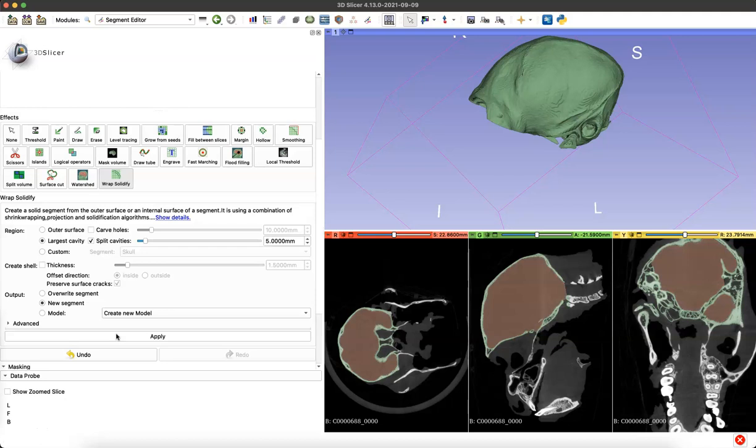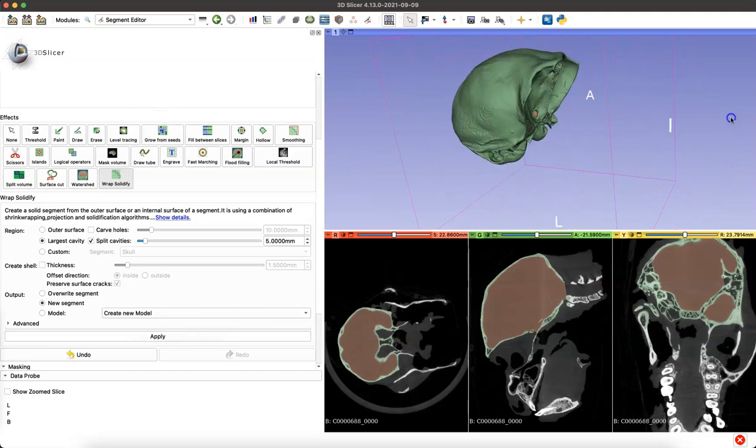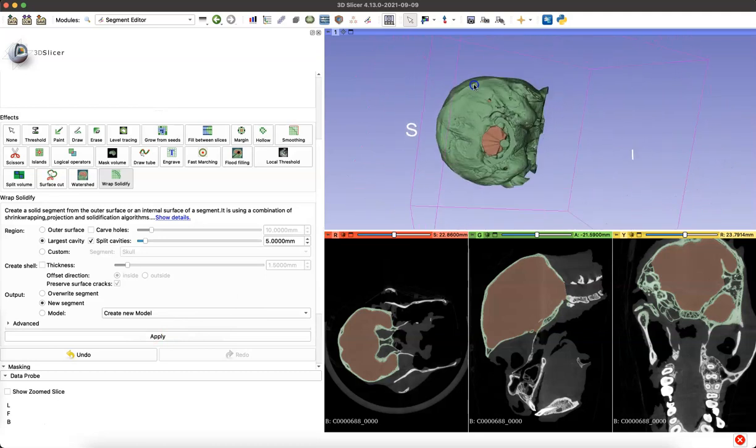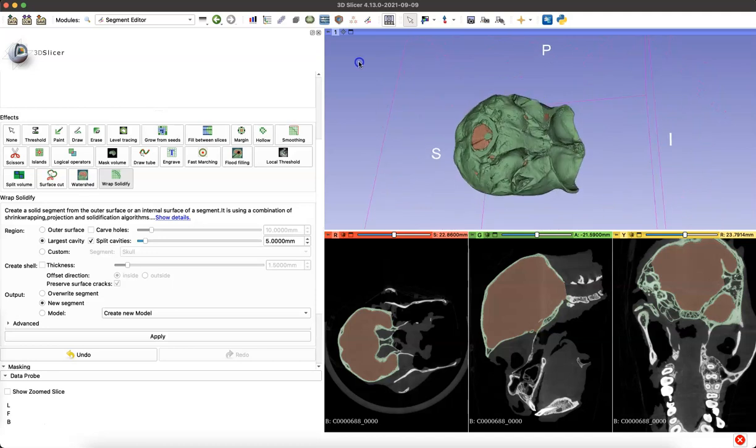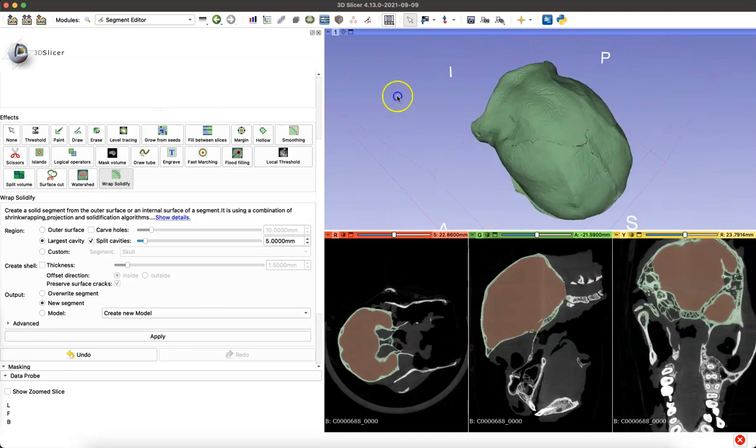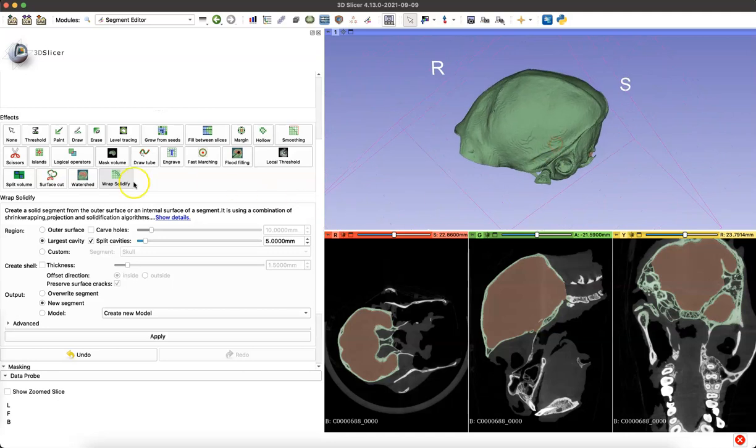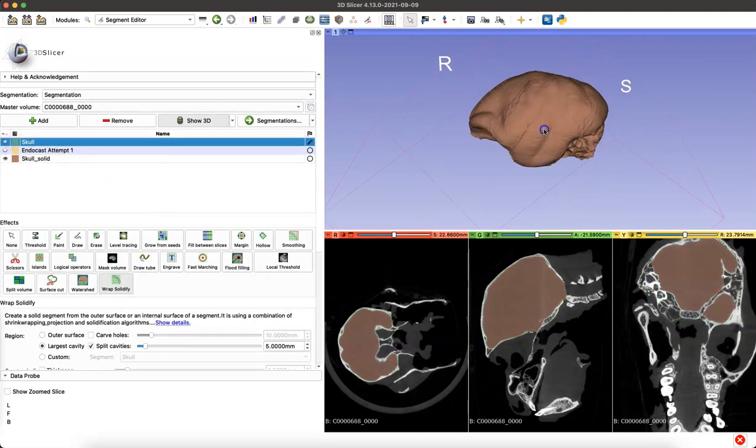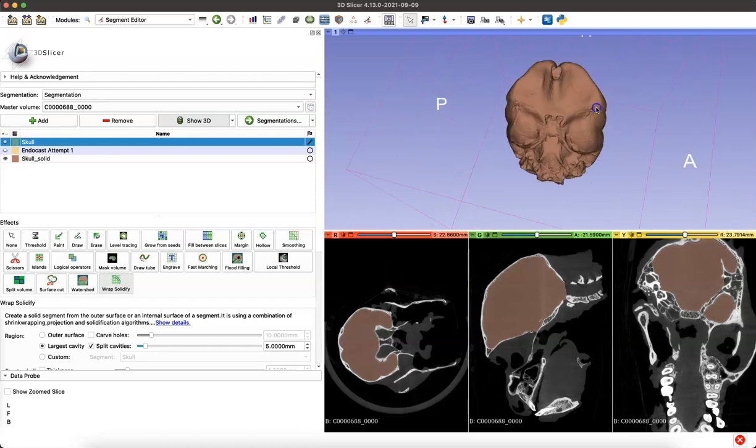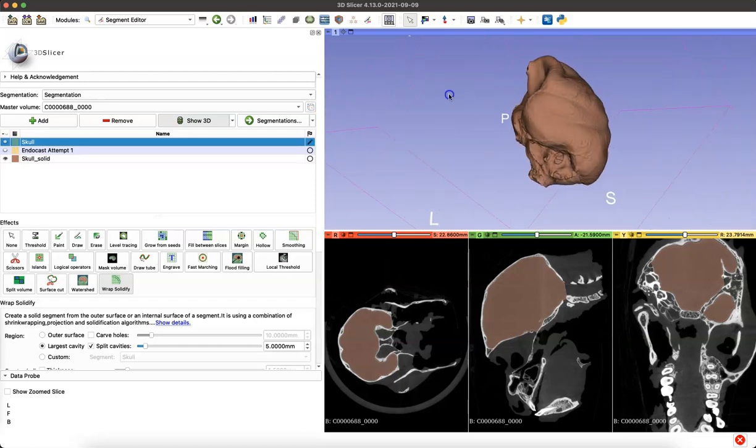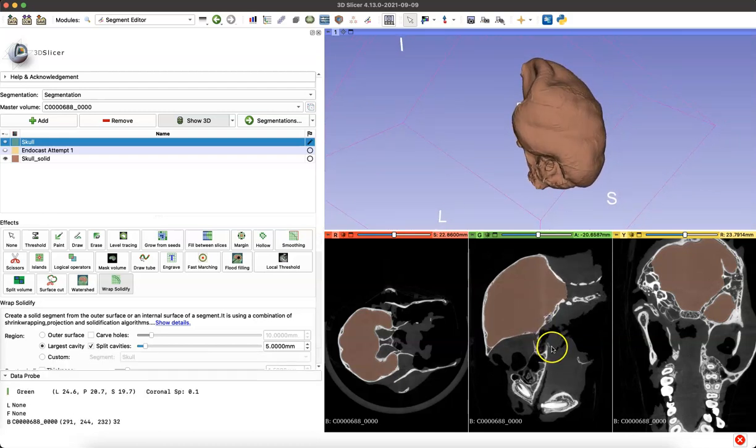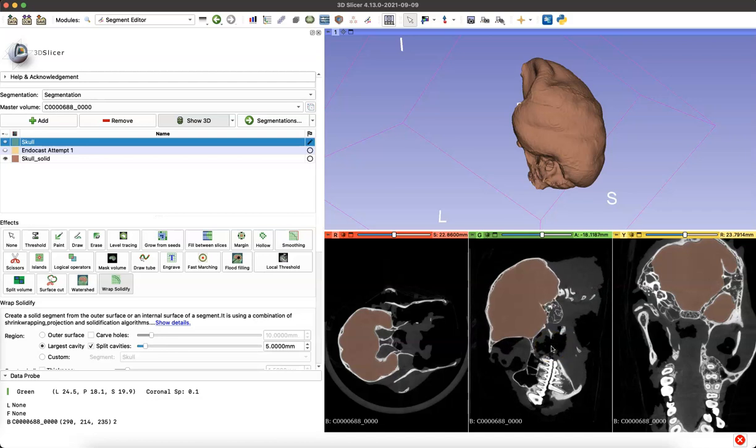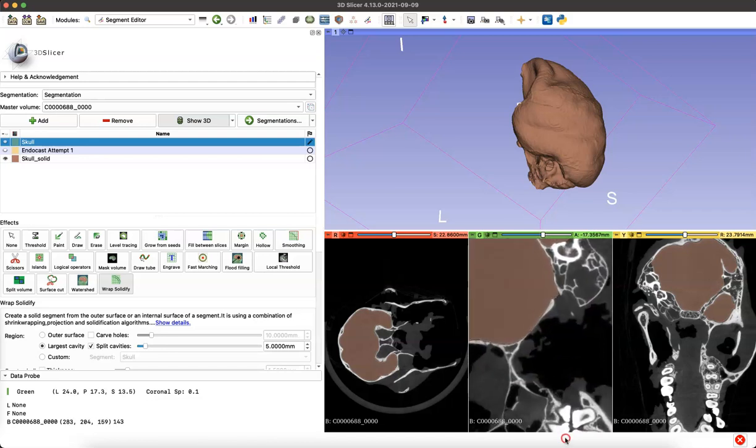Now as you can see, our new endocast, our second attempt, because we isolated that neurocranium, has filled the endocranial cavity and is cutting off at all the boundaries of those openings. So the program was able to see every foramen, the foramen magnum, that was an opening and cut off our new endocast model at that point. I can turn off the visibility of that skull model so we can see our new endocast. And we can also go through the slices and see it fills the whole cavity and it's stopping at each opening.